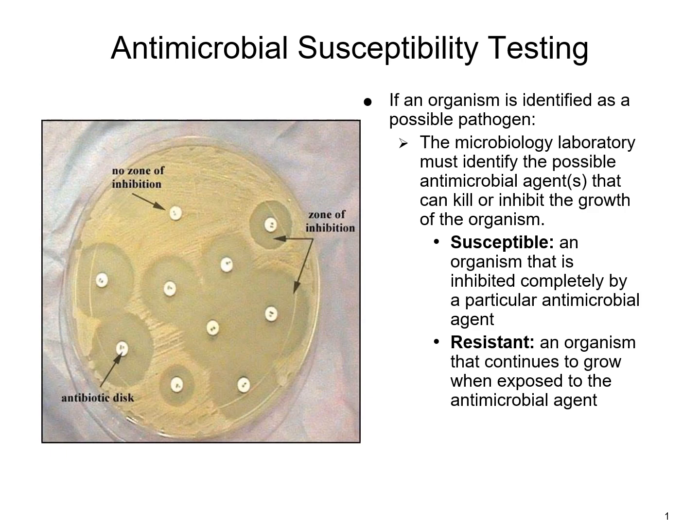So doing susceptibility testing, there are a couple of ways that this can be done, but basically you're looking to see if the organism grows in the presence of that particular antibiotic, or whether or not it is resistant. If it grows in the presence of it, it is resistant. However, if it does not grow in the presence of it, it is susceptible.